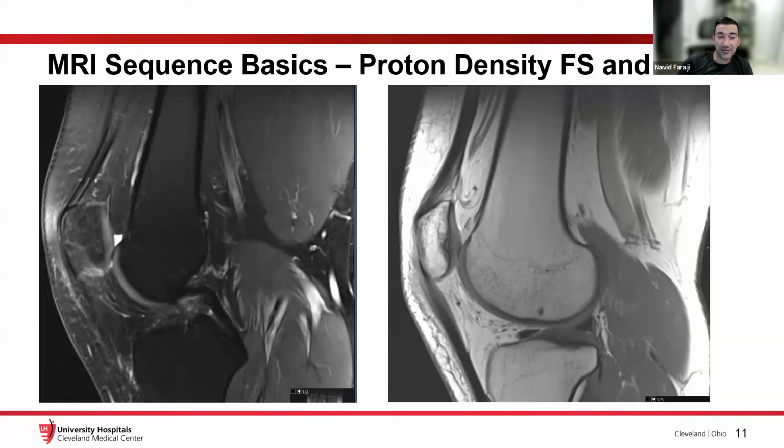I guess there are instances where you may specifically ask for a 3T or you may specifically ask for an FAI protocol just to make sure the wrong protocol isn't performed. And in our clinical setting, basically, we'll just say put in the MR hip and then in your comments type in 3T FAI or 3T labrum or just anything labrum should get you the small field of view. At least that's how it works with us.